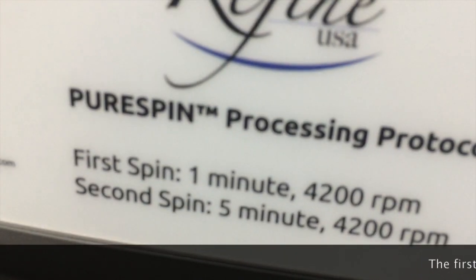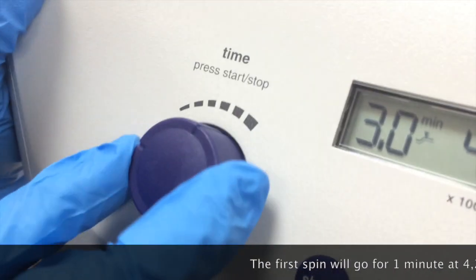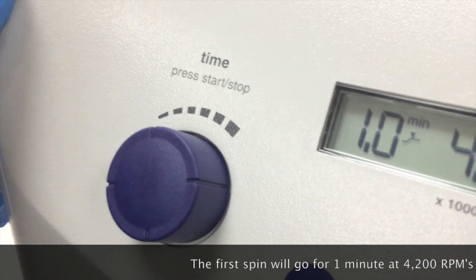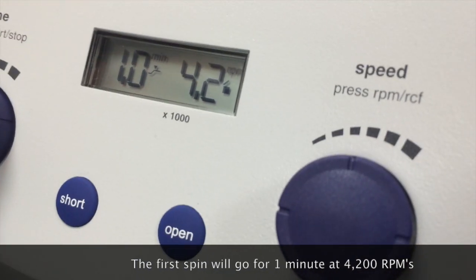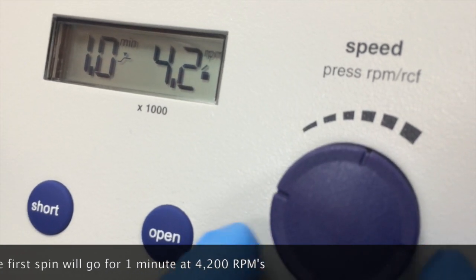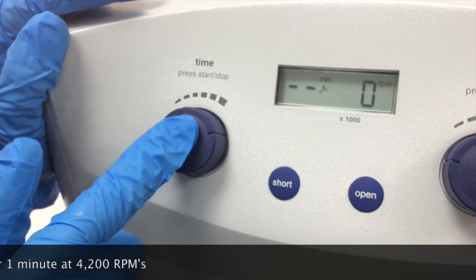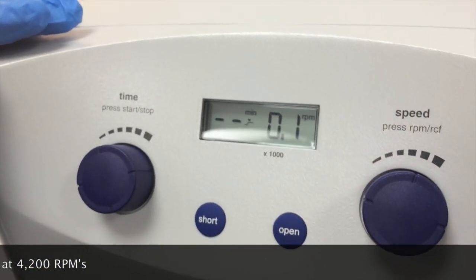So now on this centrifuge, you'll see it'll tell you: first spin, one minute, 4200 RPM. So you're going to use that dial to put it down to one, and that's already on 42. But if it was off, you just turn it to 42 — make sure it's 42. And then you're going to press the start button there. And it's going.